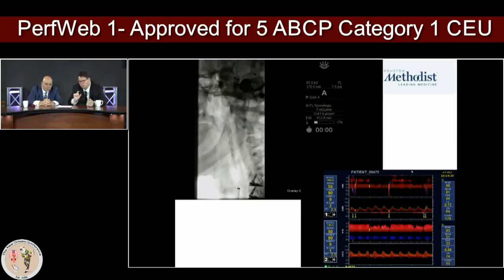So in this case, we deployed a stent and we did not see improvement of the flow. So proximal, there's something blocking that flow, and we had a tiny dissection, so we had to balloon and put a second stent proximal, and then you're able to see the flow improvement.